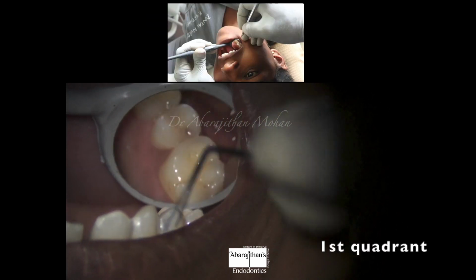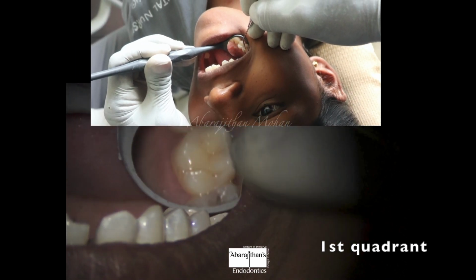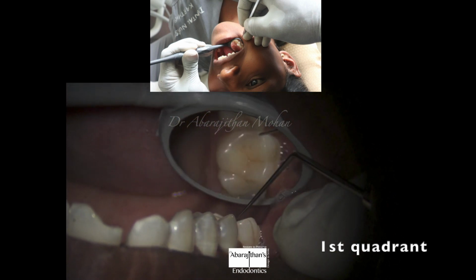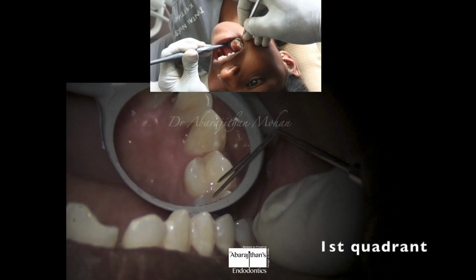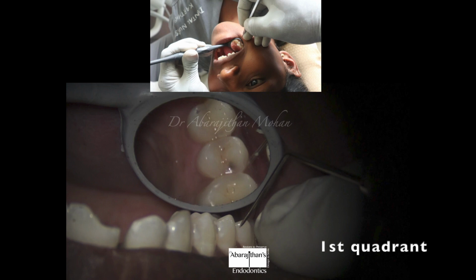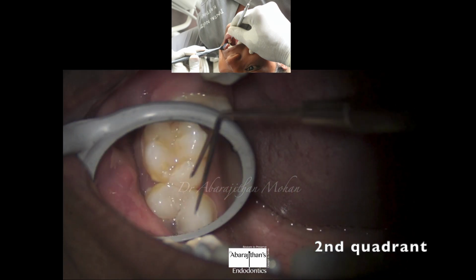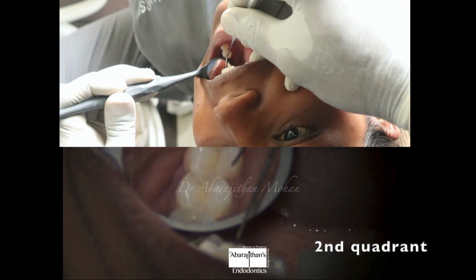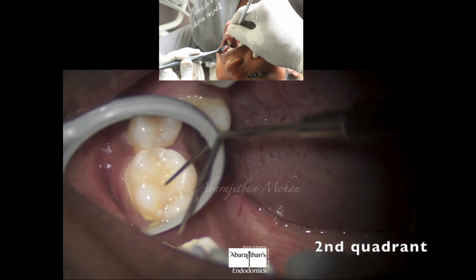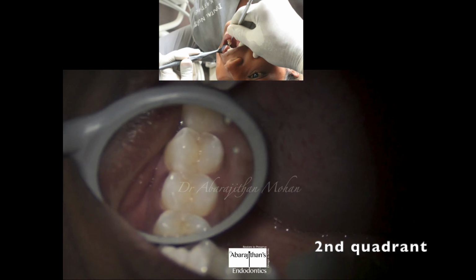So this is the maxillary molars, the first quadrant. This is how it looks, how I hold the mirror and how I use my instrument. You can see I can move the mouth mirror, I can focus the mouth mirror, I can move it from the buccal to the palatal, turn it based on the side that I want to examine or work. Now we are going to see how we hold the mouth mirror for the maxillary second quadrant, and this is how we examine. Same way I can use the mouth mirror from the buccal to palatal, tilt it to visualize different areas or different aspects of the tooth.